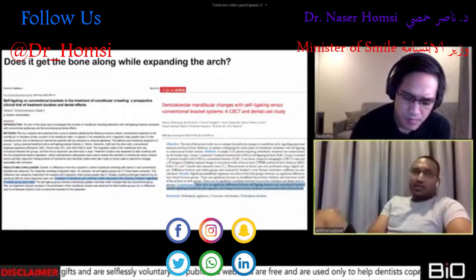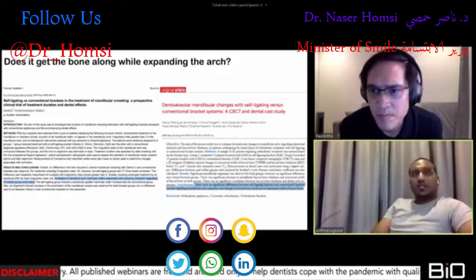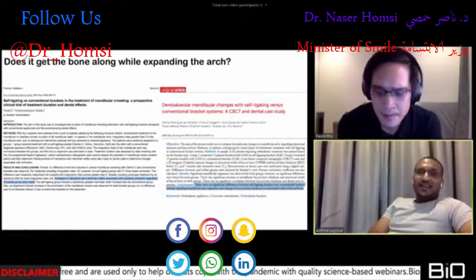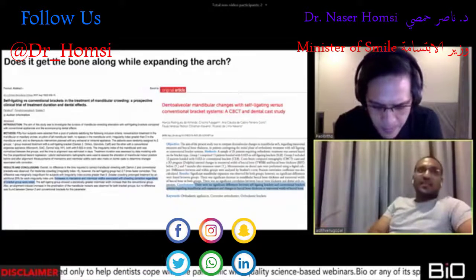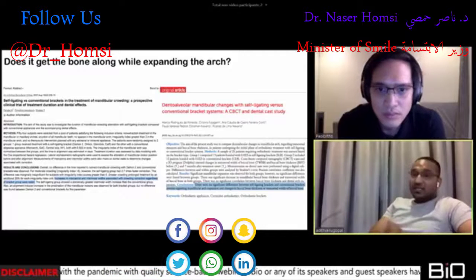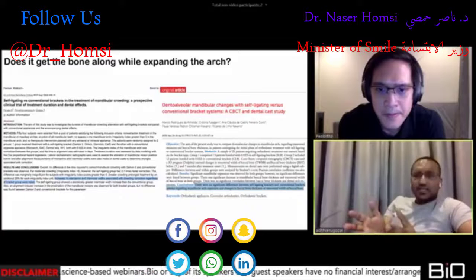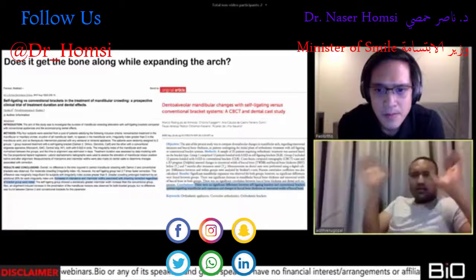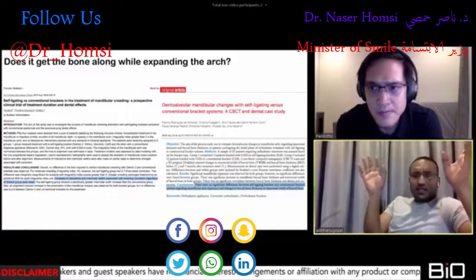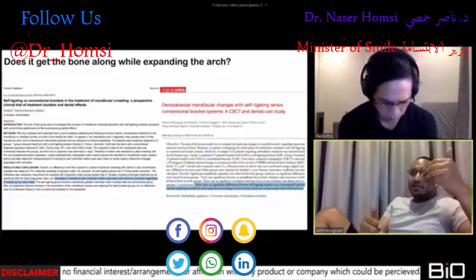And I would like to point out there was this very interesting editorial by Dr. Sheldon Peck. He was very clearly pointing out that all the propagators show CBCTs. I mean, some of them do show CBCTs, but they're very foggy. They do claim to have some amount of buccal bone around the expanded teeth, just to prove the fact, but these are not clear.